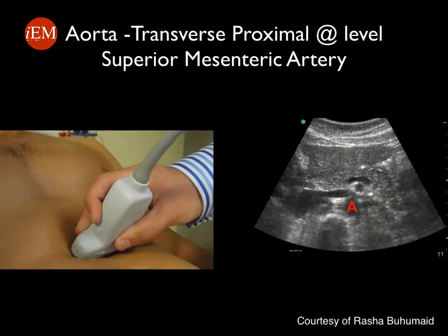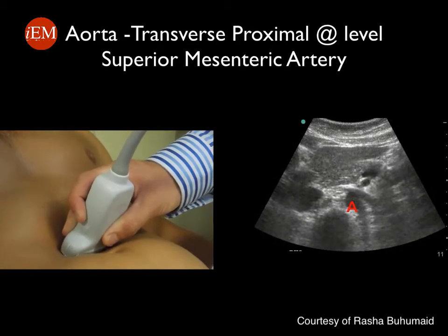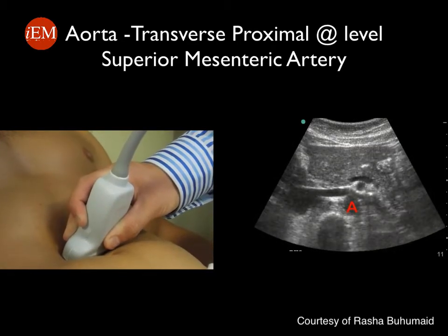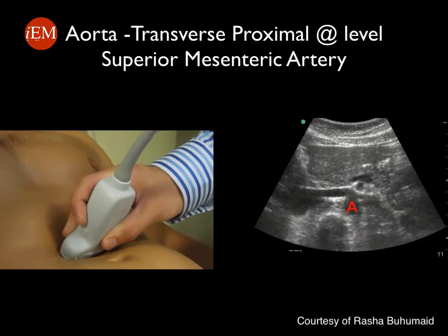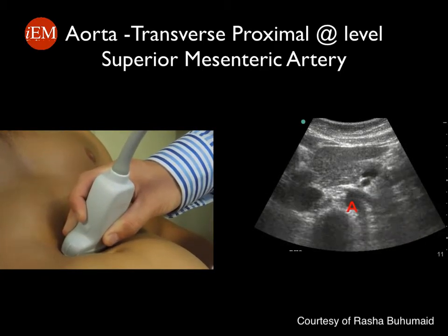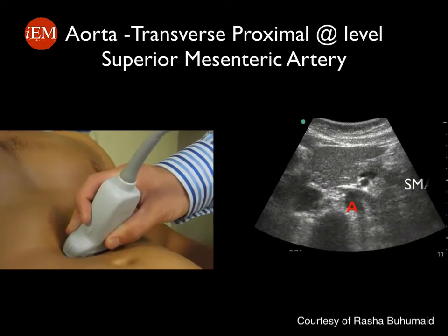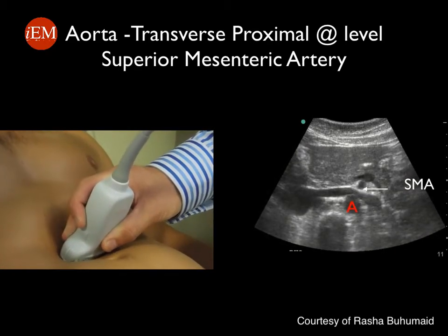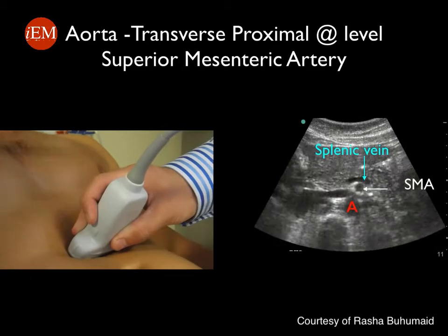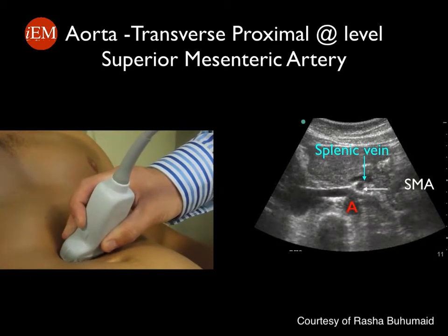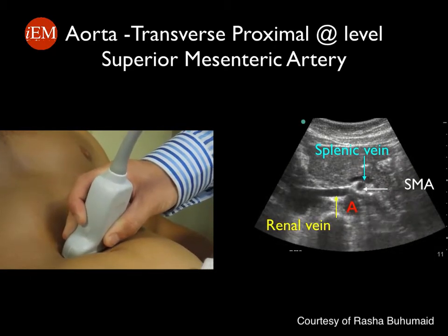Tracking the abdominal aorta more distally, at this level you can see the SMA — the superior mesenteric artery — running parallel to the abdominal aorta. You can also sometimes see the splenic vein running on top of the superior mesenteric artery, as well as the renal vein.